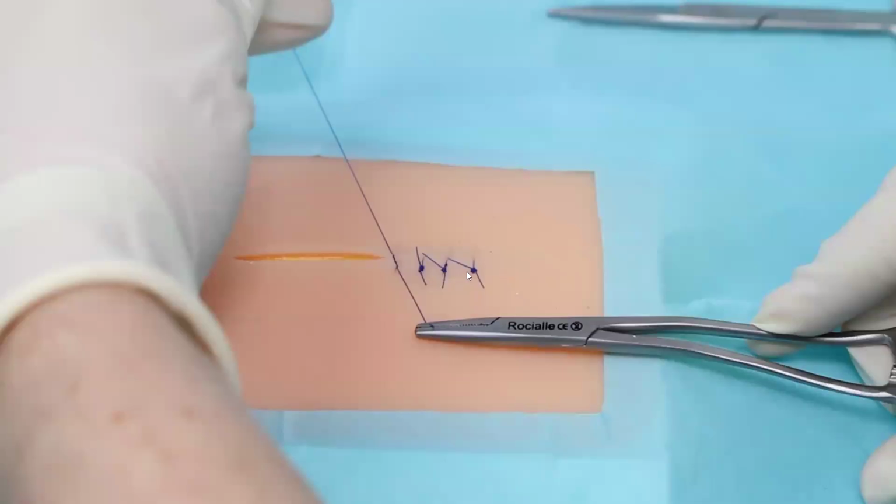How many sutures? Two, sir. Two sutures, and the interval is 1 centimeter in between. Okay? Yes. Done. Then once you finish, you will ask the nurse to clean the wound, apply adhesive dressing, and discard sharp needles and sharp objects. You can discard sharp objects and other equipment in the yellow box.